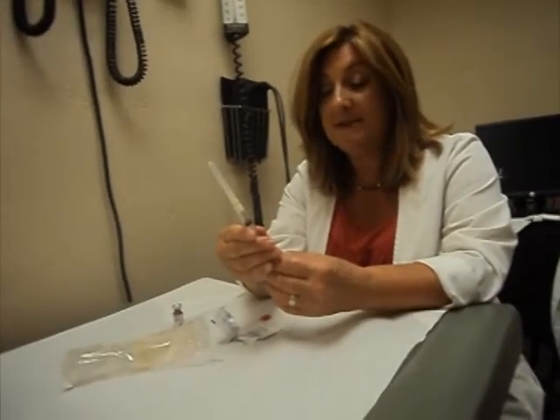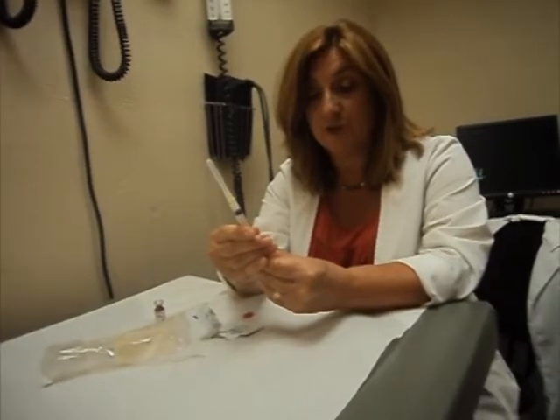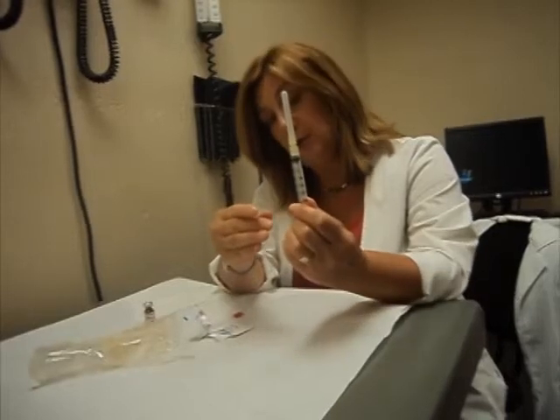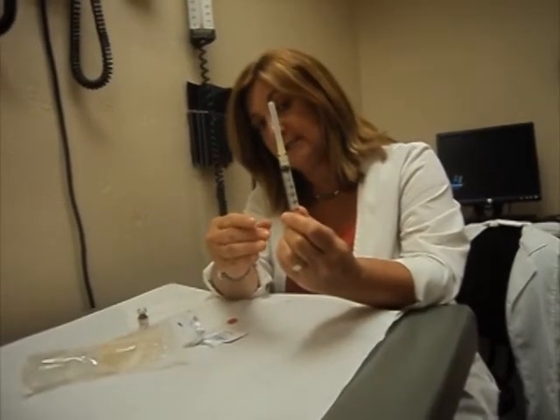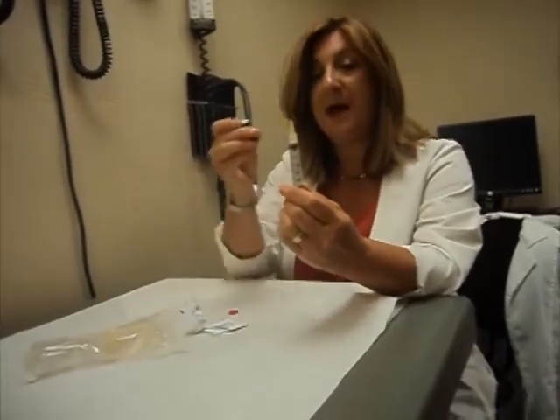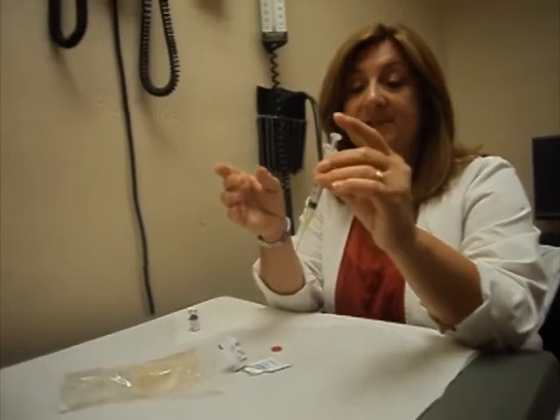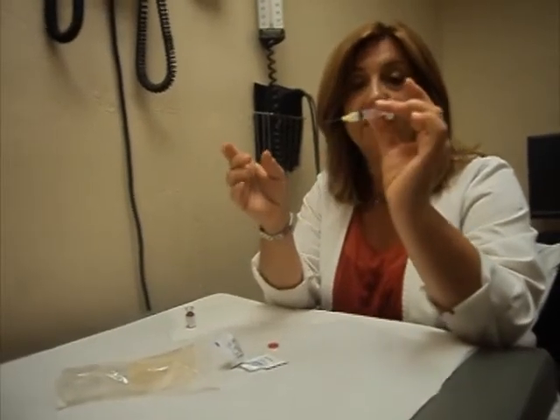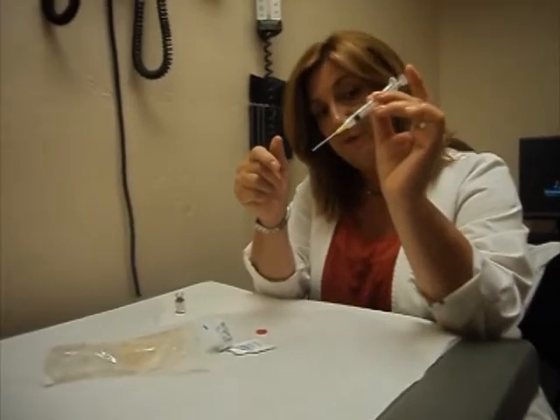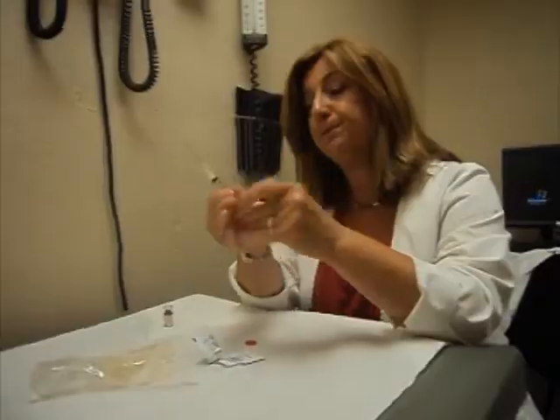For the one-dose vial, I'm not going to put as much air because it creates too much pressure. So I'm just going to put about 1/4 of a cc just to get the flow into the bottle. So your bottle is cleaned. When you're holding a syringe, basically I just like to use the dart method. I have it between my thumb and my second finger, and then I have my first finger ready to press down on the plunger as I need to.